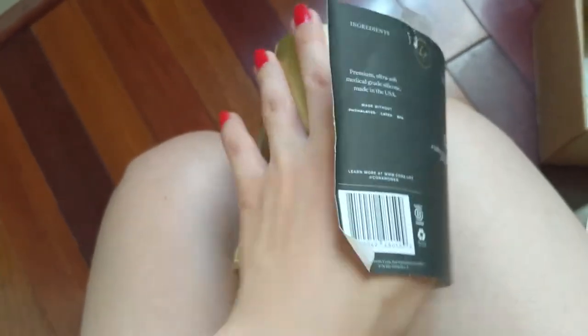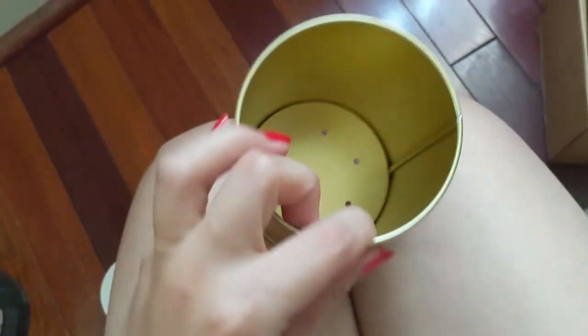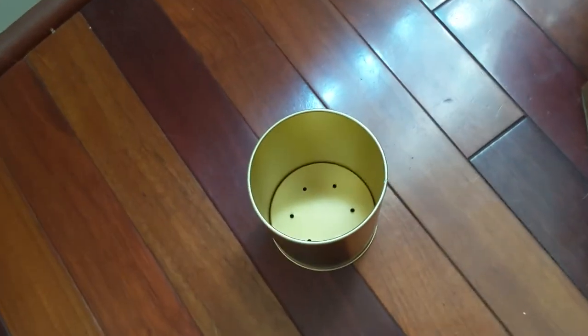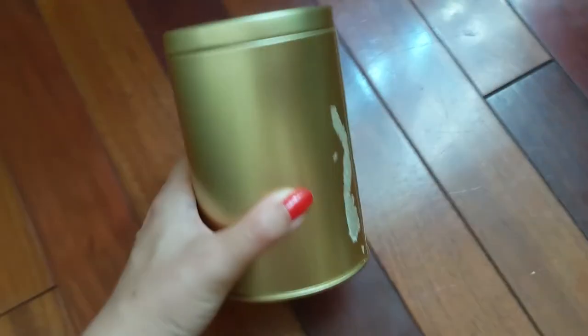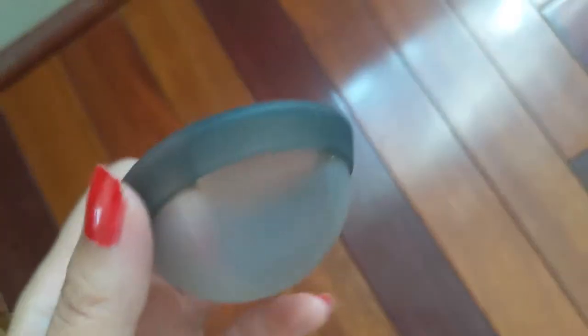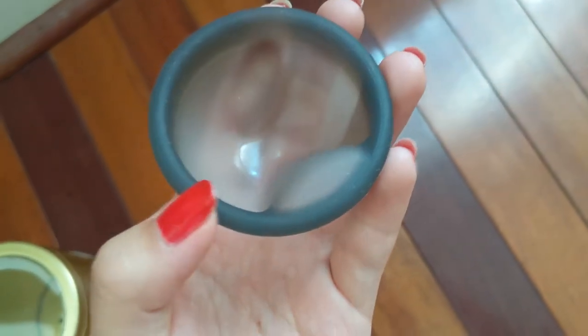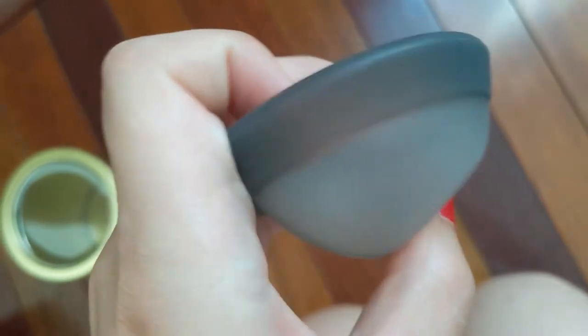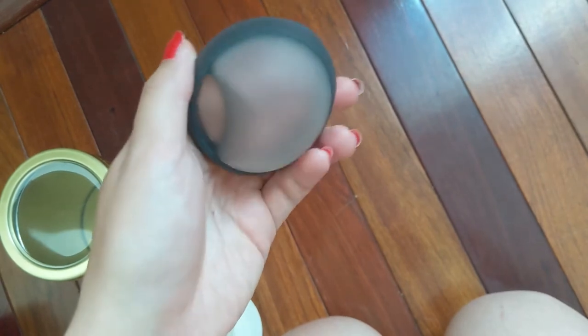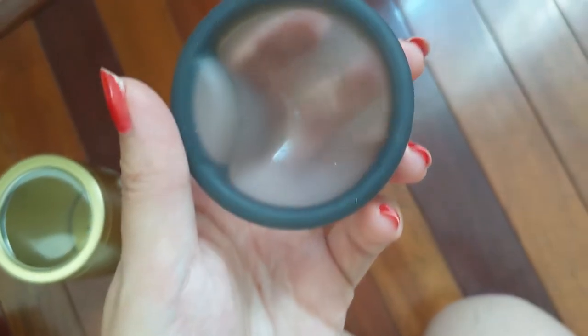Once you remove this label, you can use this container for anything you want. It just has some holes in the bottom — it's made of metal and it's really cute. Here's a closer look at the cup. It has the Cora label on the edges, and it looks like this from this side. It's a pretty sizable finger notch.